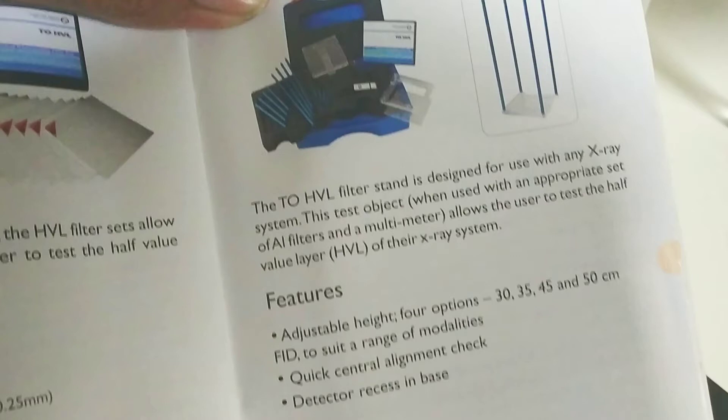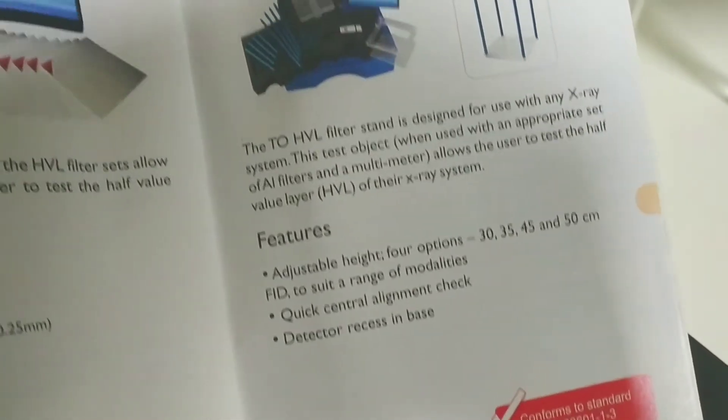allows the user to test the half value layer, HVL, of their X-ray system. The spot which we are getting in the center shows concentric circles. These concentric circles are because of that HVL filtration.